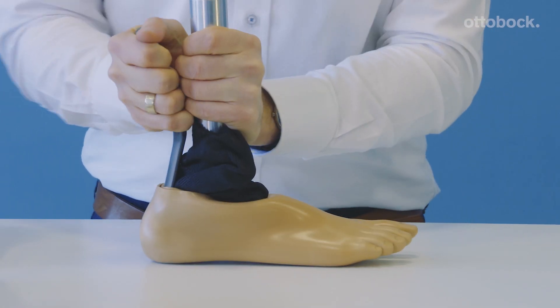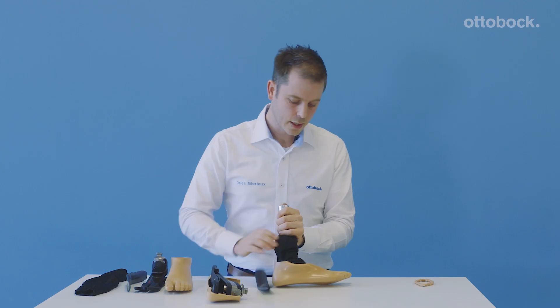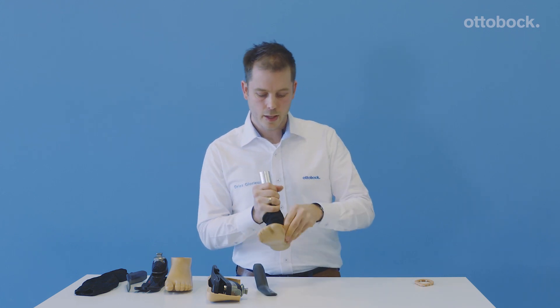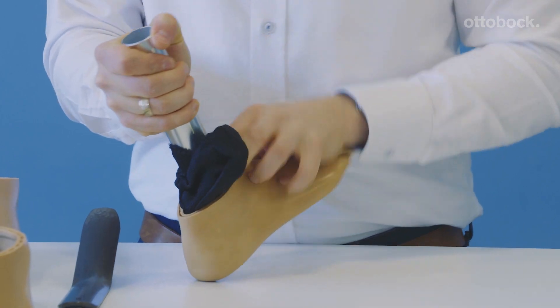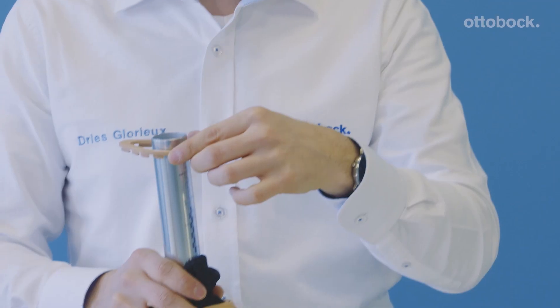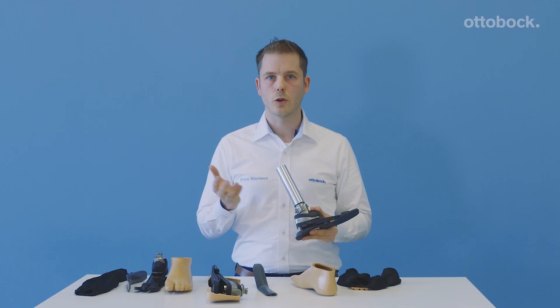You take the foot and mount it like this. You can see here the unit is not completely integrated, but that's easy to fix. You just take your finger and make it nicely. And never forget to use this one extra on top.